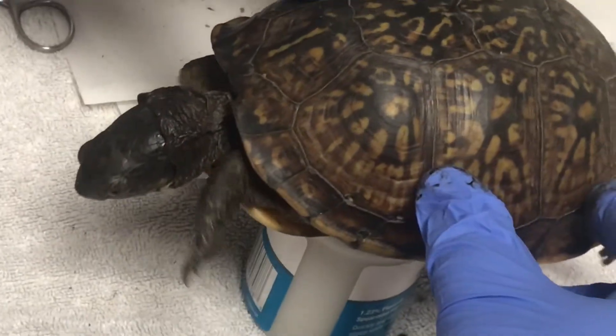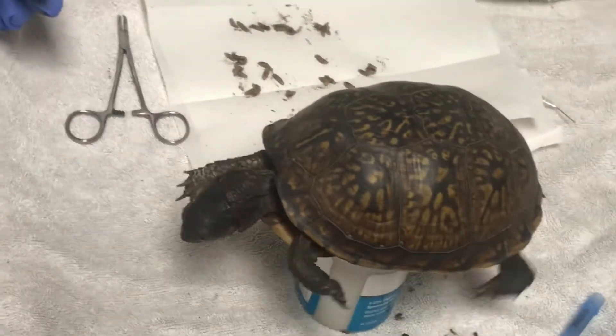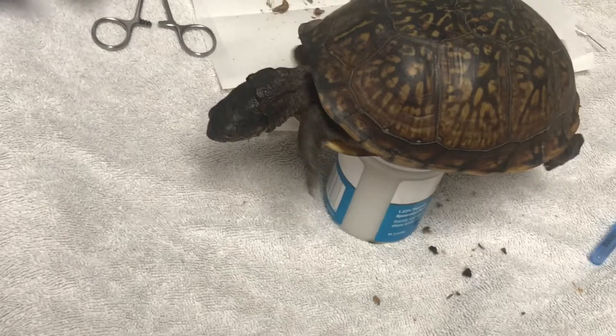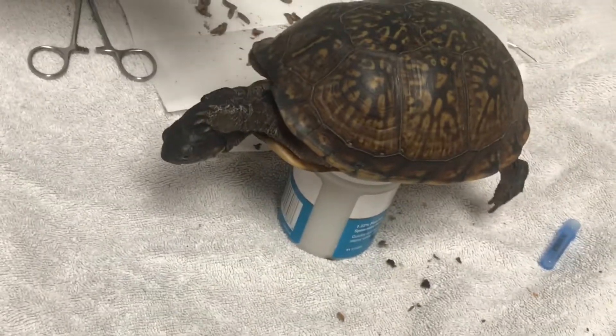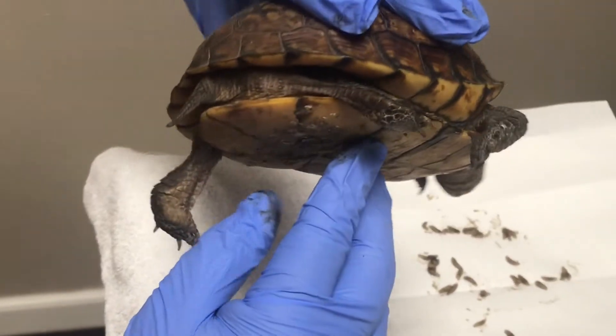Is he going to make it? You're going to make it. You're going to live. Swim, Widow Turtle — keep on swimming. Let's check your butt. You've got some various issues back here. Nope — we got them all.